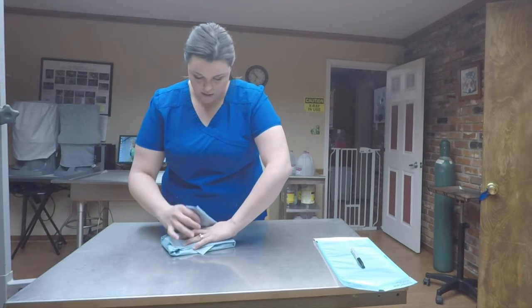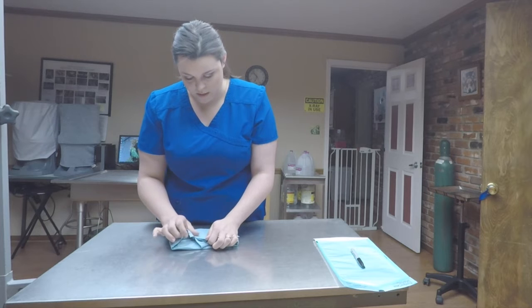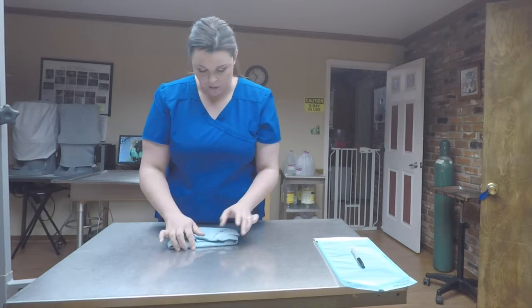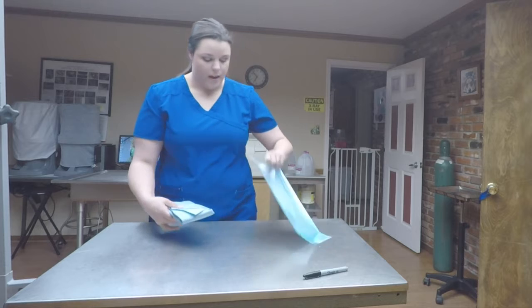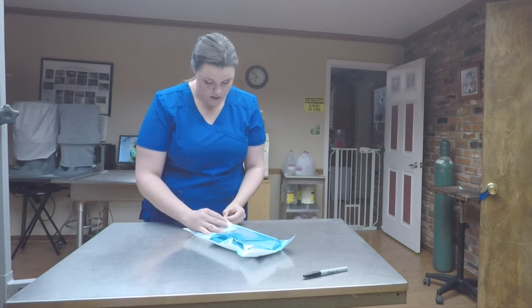You'll fold in half and then tuck under and leave the pull tab for them to be able to pull on. And then, there we go. Then you will put it in we have these sealer containers, or sleeves, to put it in.